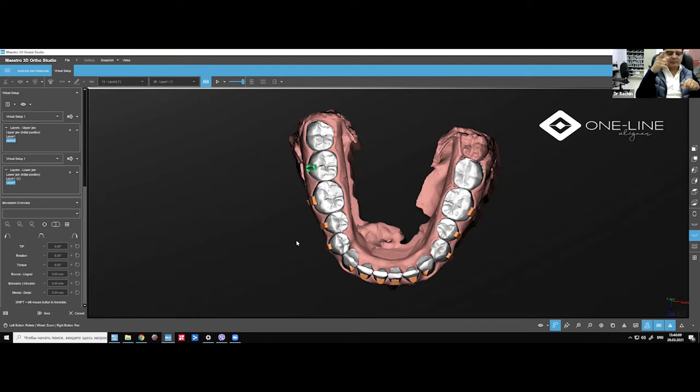So I make the last aligner with the CA sheet, which is a little thicker. Not thicker, it's a little hard compared to the Pro Plus. Or I use a tagless. Tagless is more hard. Then you can just press the teeth into place.